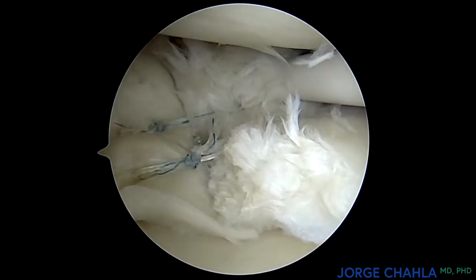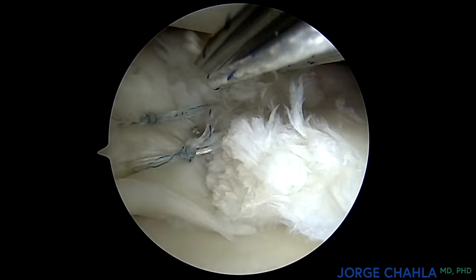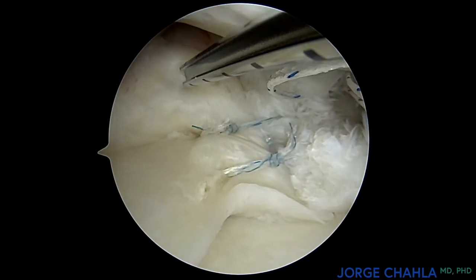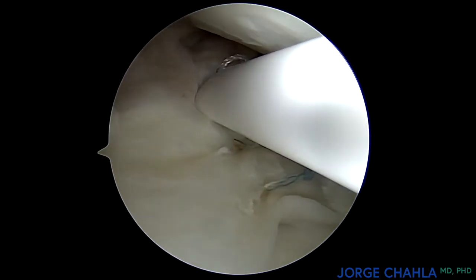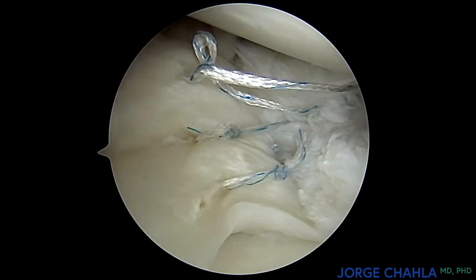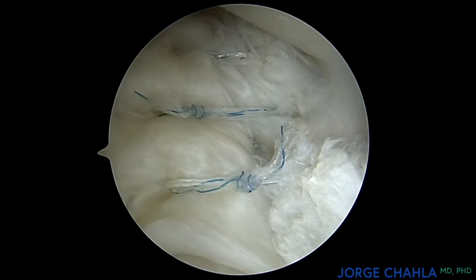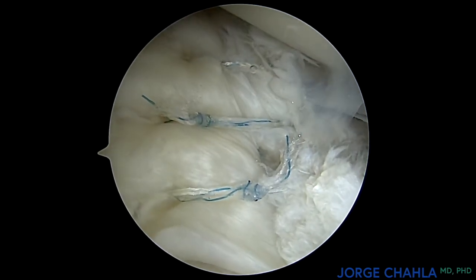A third and final horizontal mattress suture is placed at the meniscocapsular junction at the same distance anteriorly and posteriorly. Final tensioning is confirmed under direct visualization.